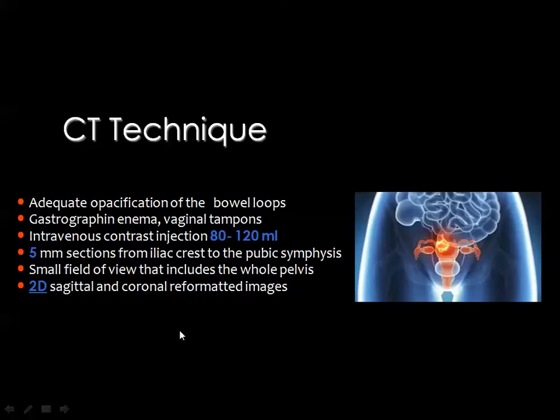And we use a somewhat small field of view to include the whole pelvis and to delineate the organs in a good manner.